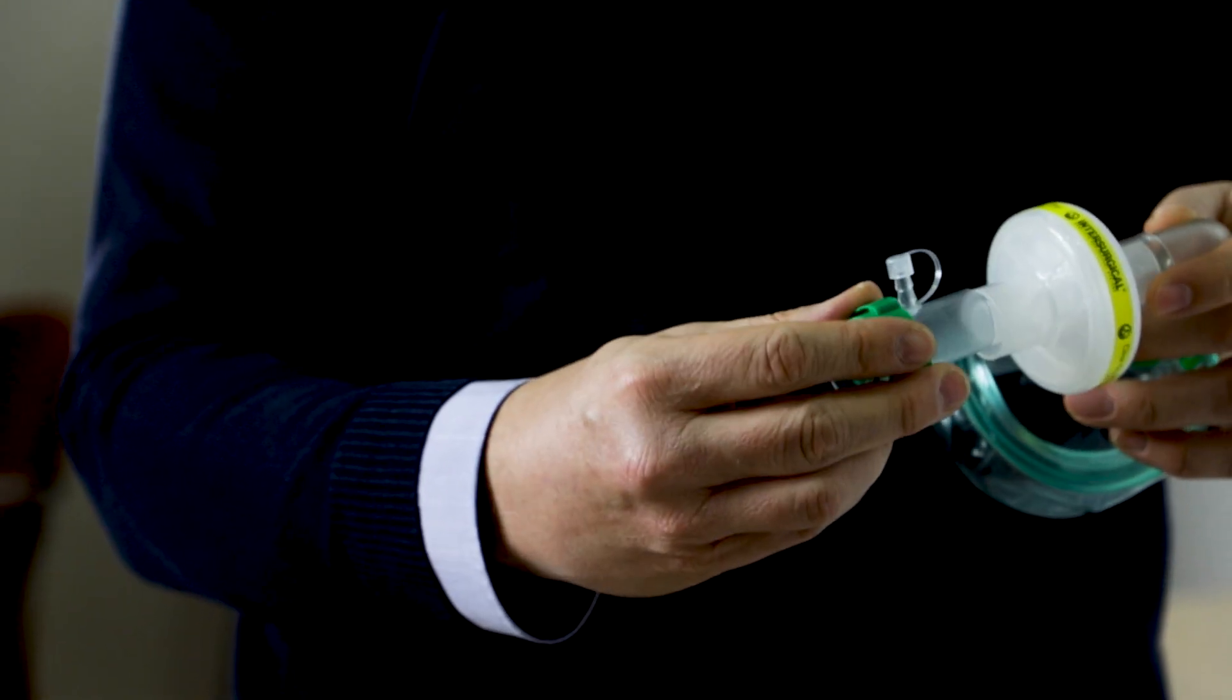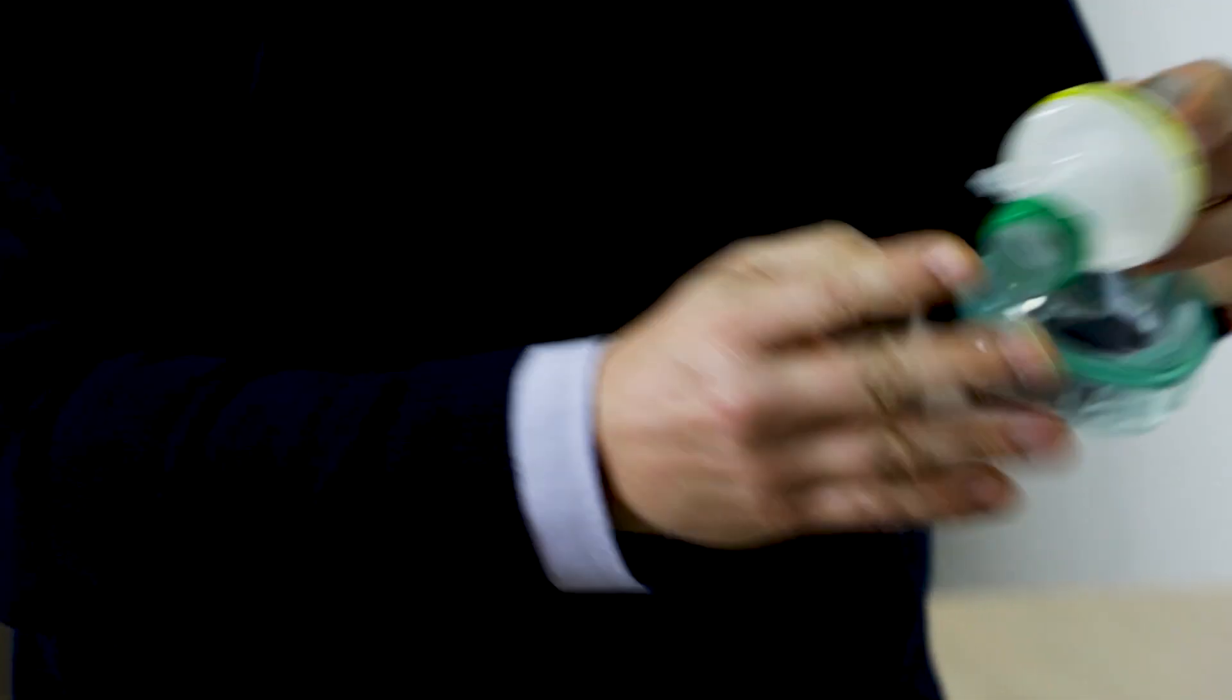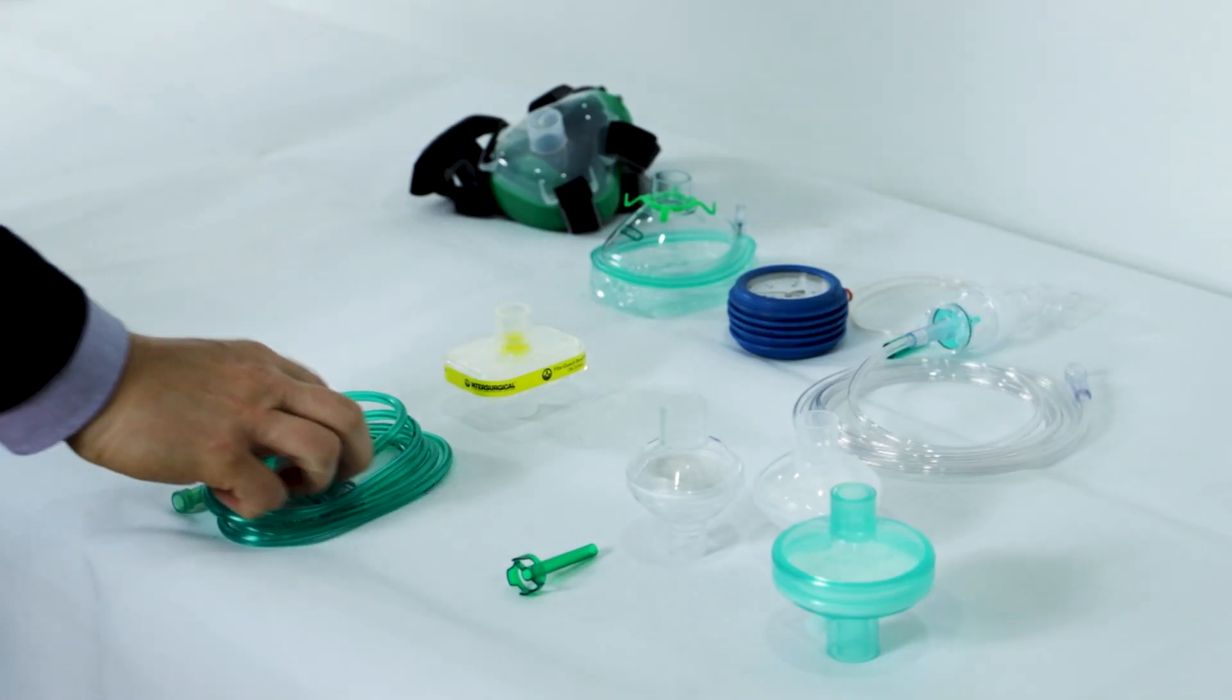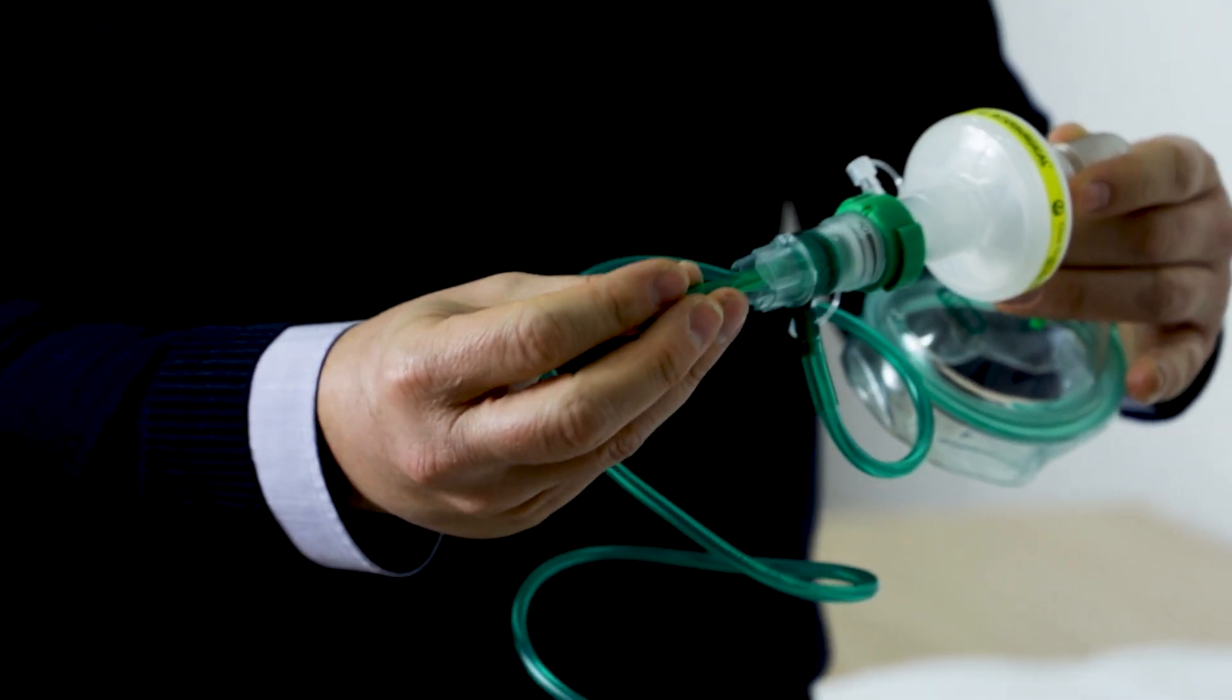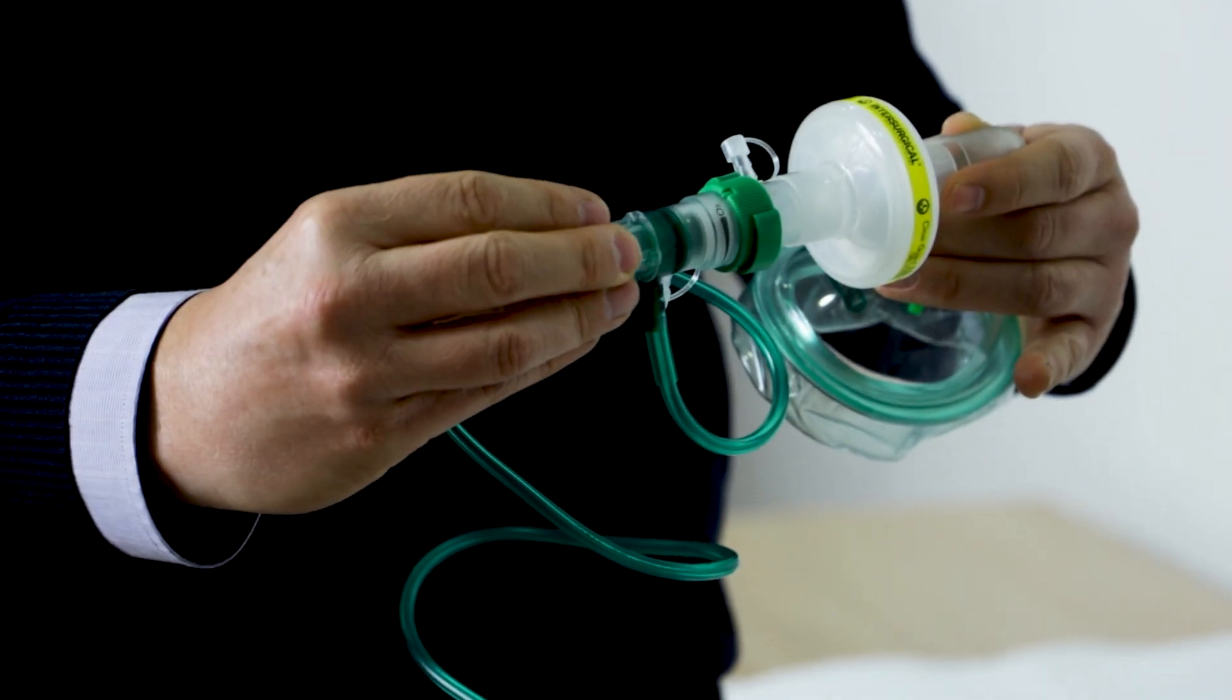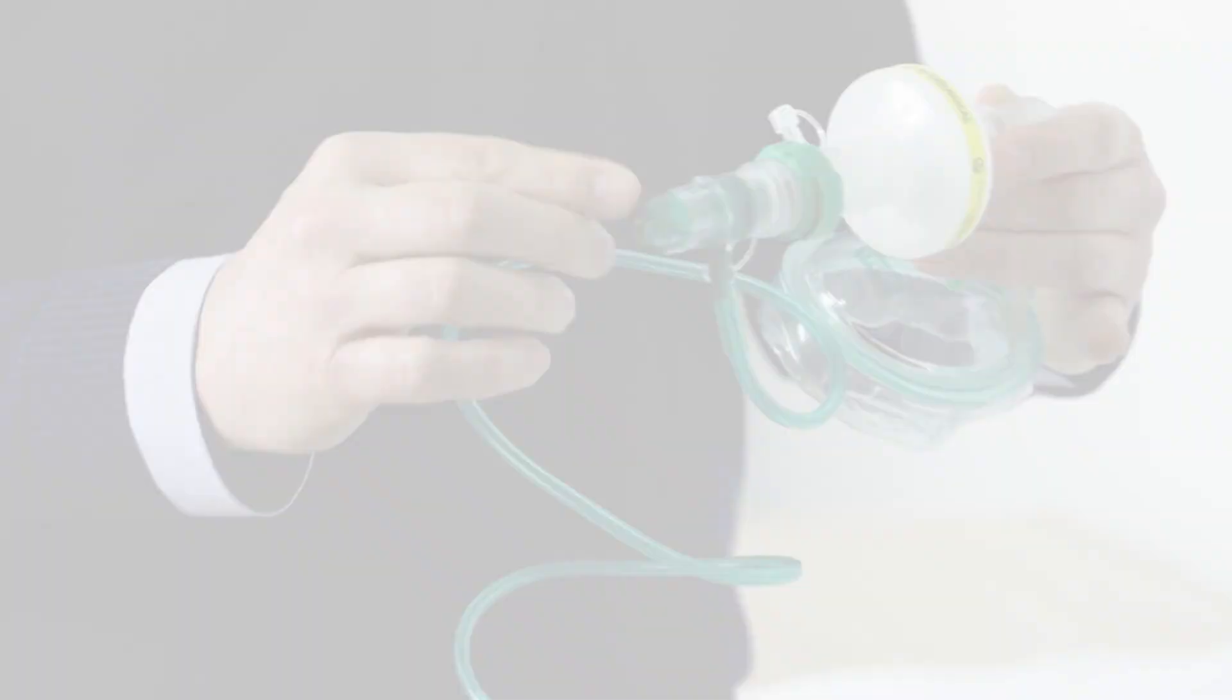After fitting the filter, we need to connect the FiO2 ring like this. And finally, we need to connect the Boussignac valve with the noise reductor to reduce the noise and to decrease the turbulent flow.